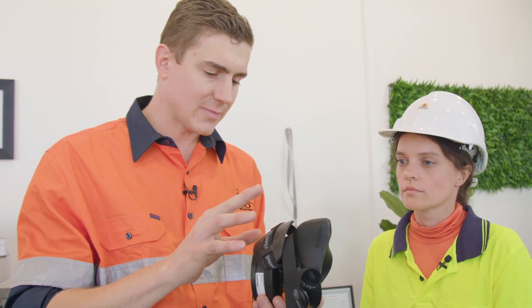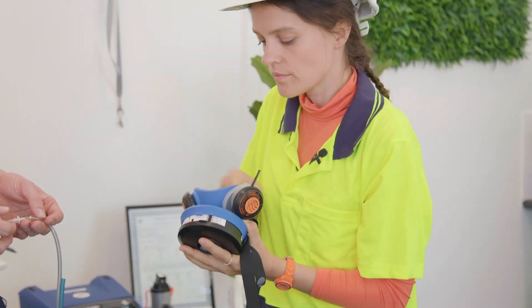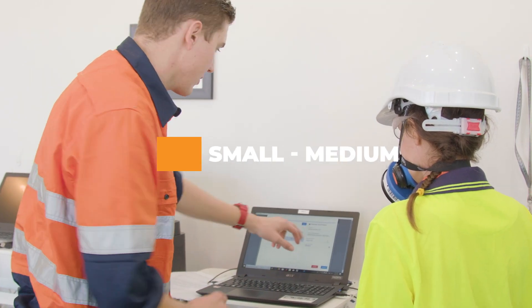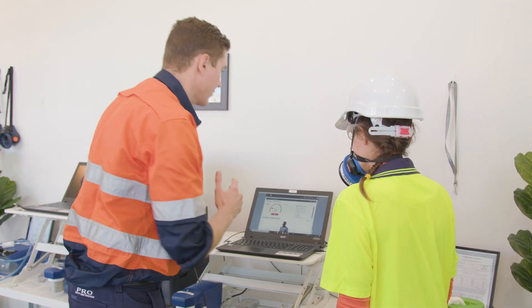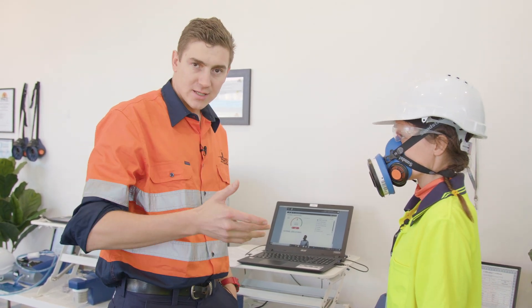So Yulia we're going to be testing you with a number of different respirators and seeing the best one that seals. We're testing you on a Sunstrom Si100 in a small medium. Now all I want you to do first is just nice relaxed normal breathing, nice and easy.